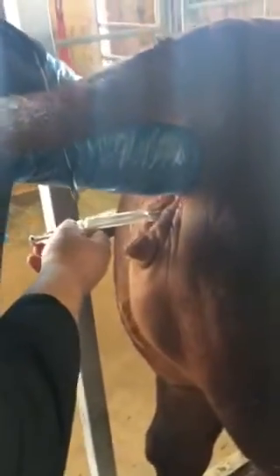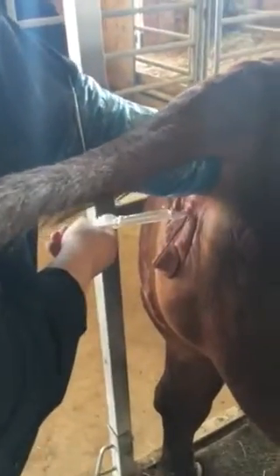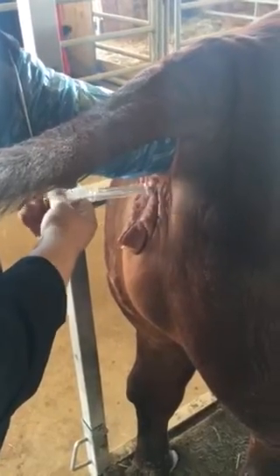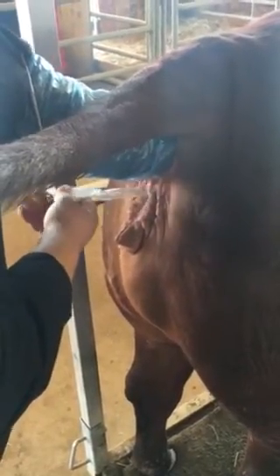Now what I have to do is find her cervix — the hole or the center of her cervix — and weave this gun through her cervix. And it's in. Once you're in, you'll feel the little folds I was explaining earlier. Her cervix is real soft, so she's in heat — good timing right now. I'm definitely in, and I'm into the uterine body.